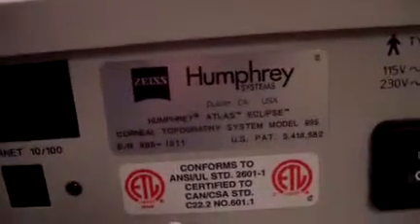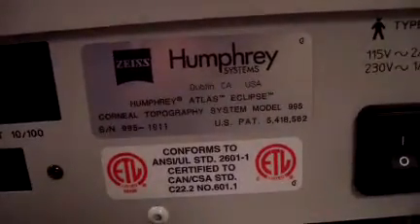Hey, it's Keith from DCSP Medical. Today we're looking at a Zeiss Atlas 995 corneal topographer that we just brought in. It's in excellent cosmetic condition and has the keyboard with it.